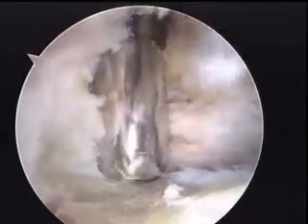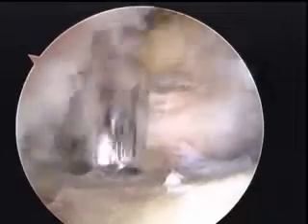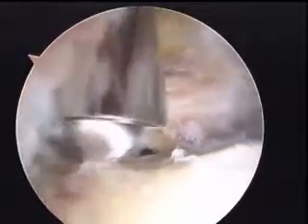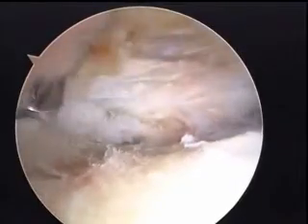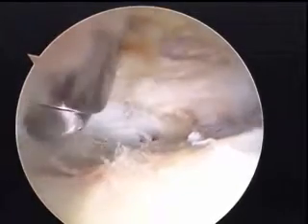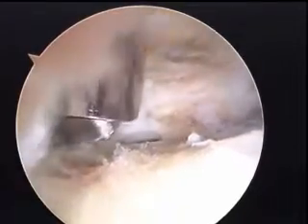You can see we've gone down a good 4 or 5 millimeters right in this area. And we will continue this distally down the femoral neck. He's only in about 45 degrees of flexion right now. So if we brought him up to 90 degrees, this whole area would be hitting where we just did our repair. You can see we're taking that down quite a bit.